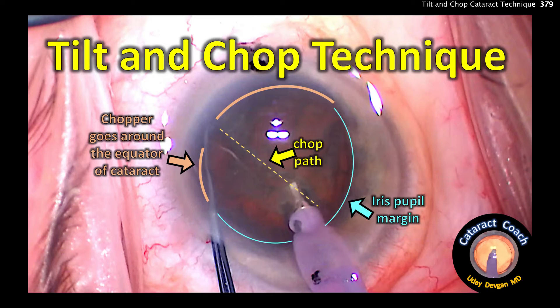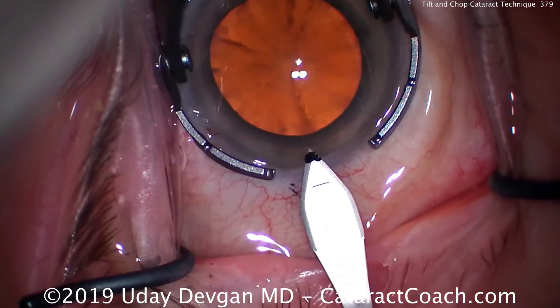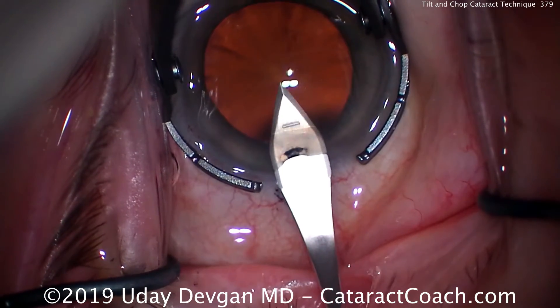CataractCoach.com, the tilt and chop technique. We can see the nucleus above the pupil margin for about 180 degrees. Let me show you the technique here. We've already filled the anterior chamber with viscoelastic. Here's the main incision — that goes beautifully, very nice.